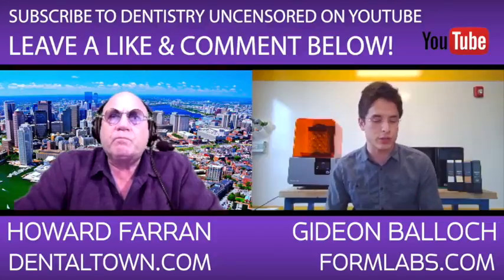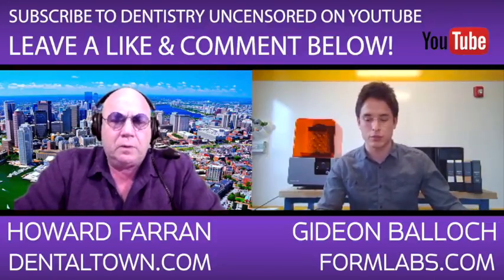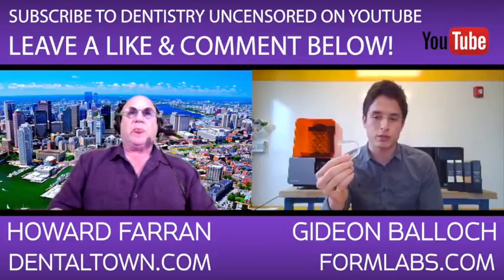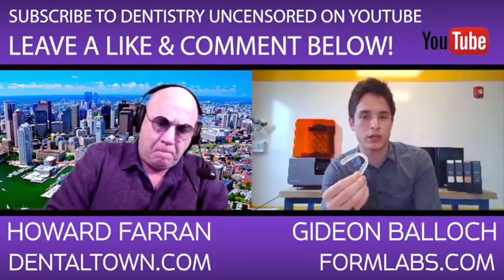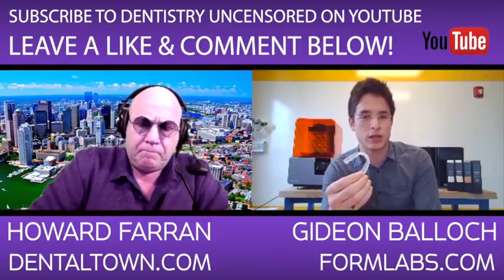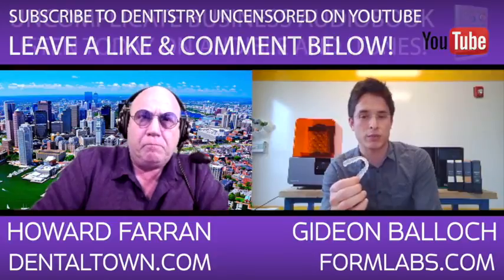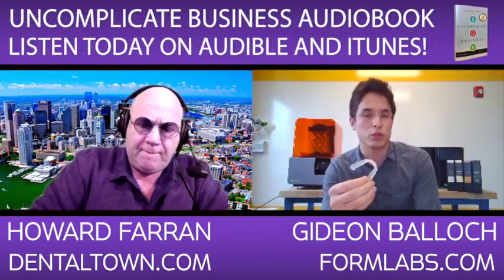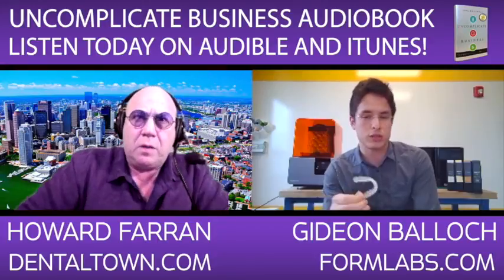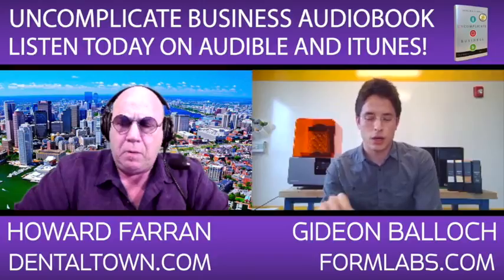So just to give you an example, one thing that's a really great application for 3D printing right now is 3D printing splints or surgical guides. To mill an object like this out of a CNC dental milling machine would take several hours. It would waste a lot of material, and you generally would get a lower quality part than you could get out of a 3D printer. So that's an area where a printer has a major advantage right now.